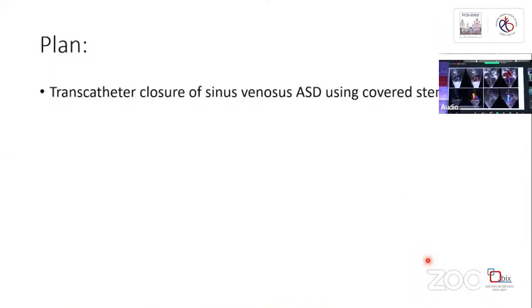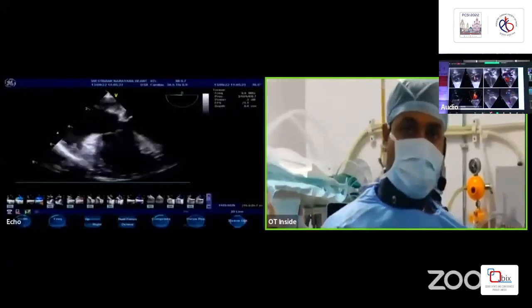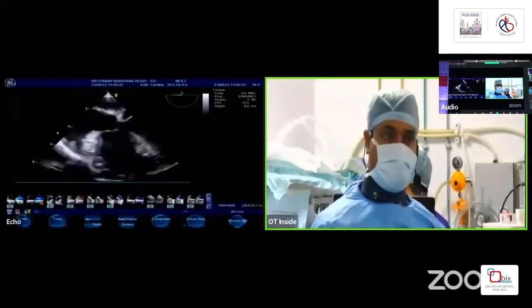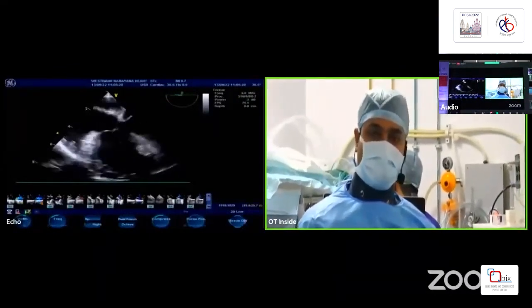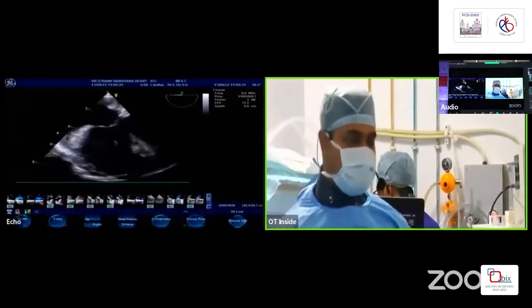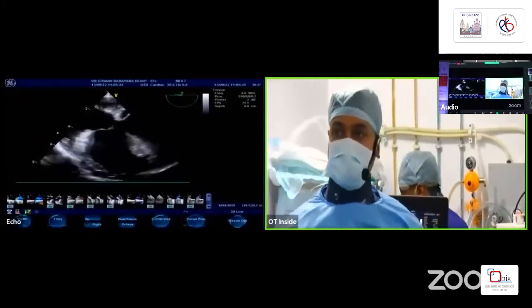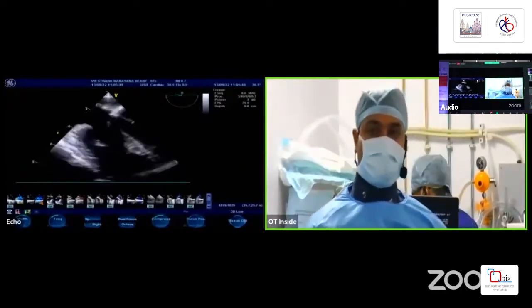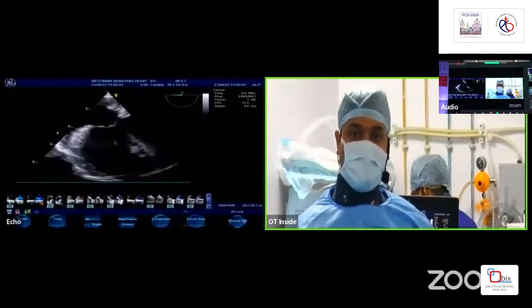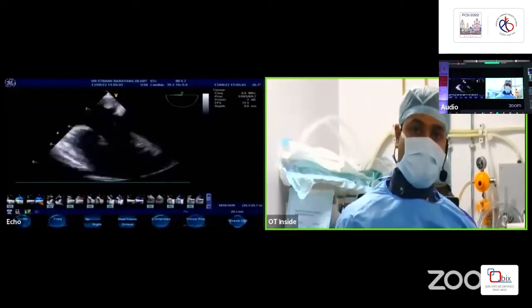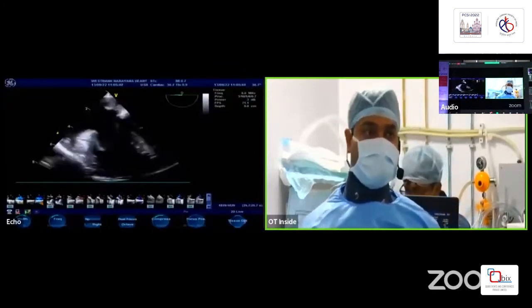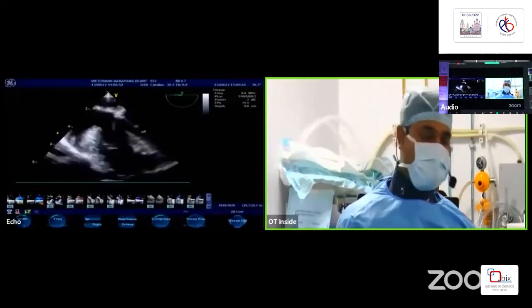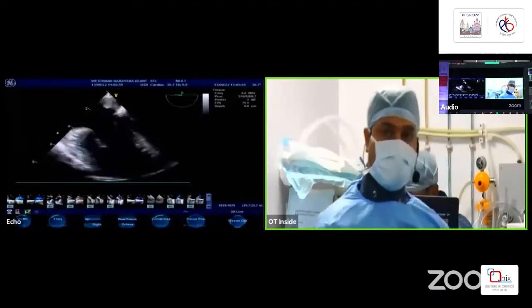Good morning everyone. We are live from Narayana Super Specialty Hospital, Howrah. We are planning to do a transcatheter closure of a sinus venosus ASD using a covered stent. This is a 16-year-old boy, 58 kg body weight, where transthoracic echo measured a 17 to 18 mm sinus venosus ASD with partial anomalous venous drainage of the right upper pulmonary vein. A CT scan was also done. Now we will focus on the transesophageal echo.